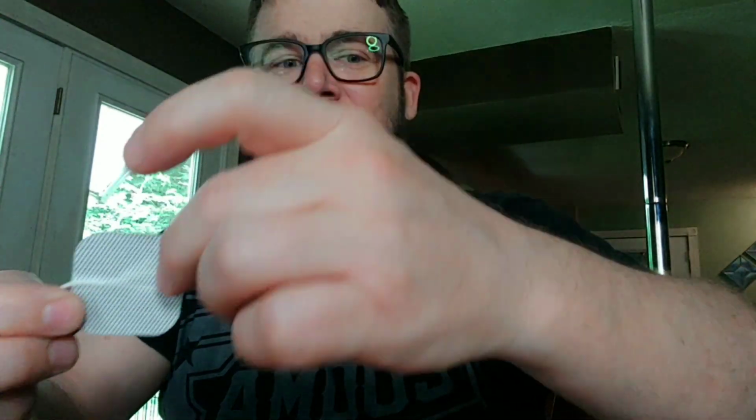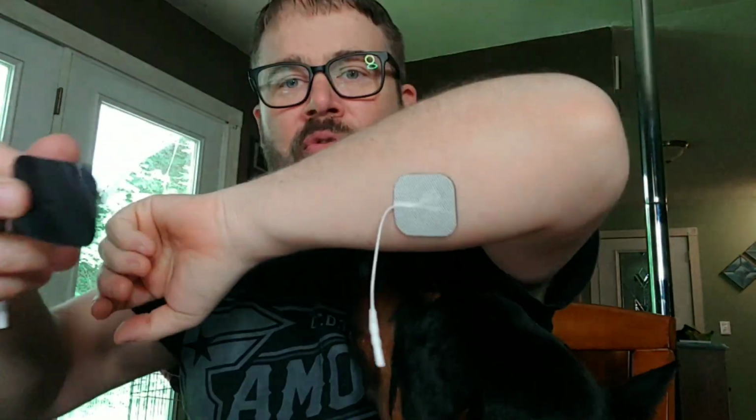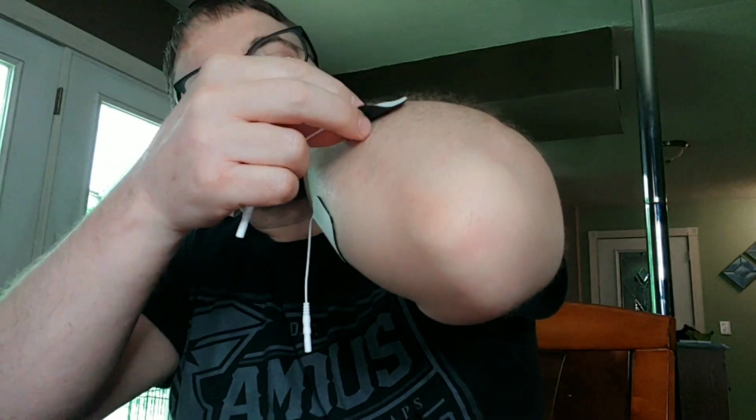Alright, so I want to use 2 of these right here. You peel these off right here, and we're going to stimulate this muscle right here. I don't know why, but we're going to. You have to use 2 to make the electrical current pass. You can't just use 1 because it has to go through. Now, in my physical therapy for my back, they use 4. Let's see. Oh, let's go here. Maybe I should have shaved my hair.